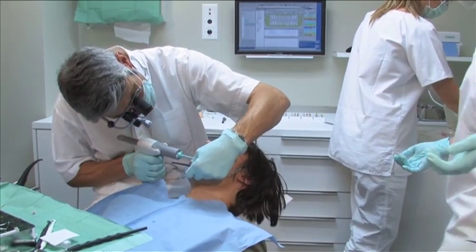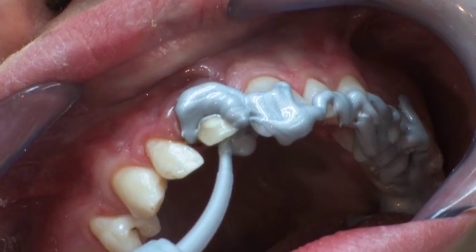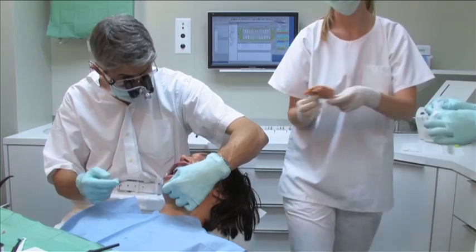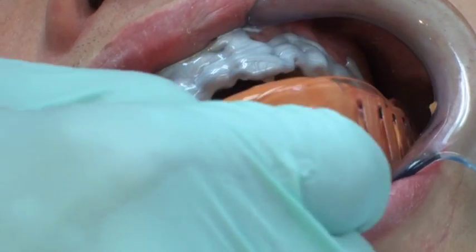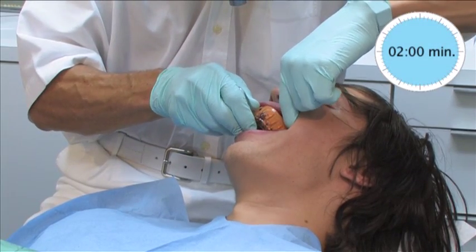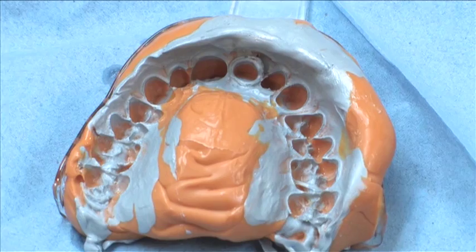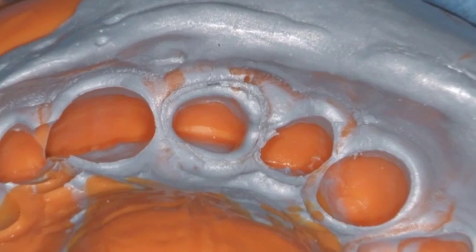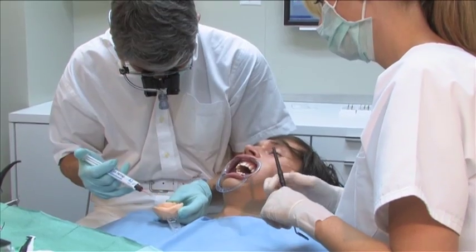Using the convenient microsystem dispenser, the wash material is easily applied directly into the mouth. Filling of the tray and syringing the wash material should be completed simultaneously. The one-step putty wash impression is performed using a Finis Heavy Body and a Finis Precious Light Body. This precision impression material distinguishes itself by its easy readability of detail thanks to its silver pigmentation.